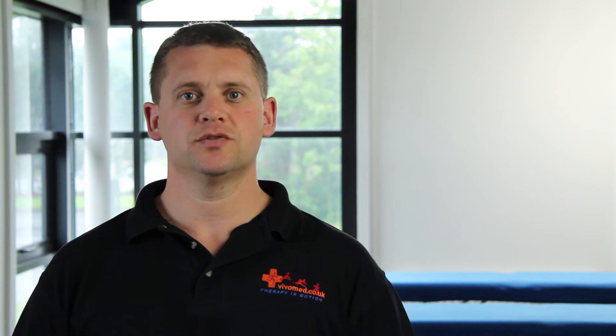Zinc oxide tapes are rigid strapping tapes used in situations when a therapist requires a tape to restrict or immobilise a joint. Consequently, these tapes are rigid inelastic tapes and are widely used in sports medicine and clinical physiotherapy practice.